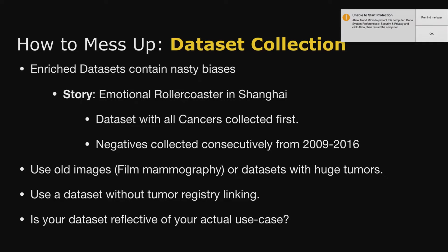If you find a public dataset, that's most likely going to be like 50-50 cancer, not cancer. And oftentimes these datasets can have some sort of bias within the way it was collected. So it might be that you have negative cases from fewer centers than positive cases, or they're collected from different years. And actually, this is something we ran into earlier in our own work.